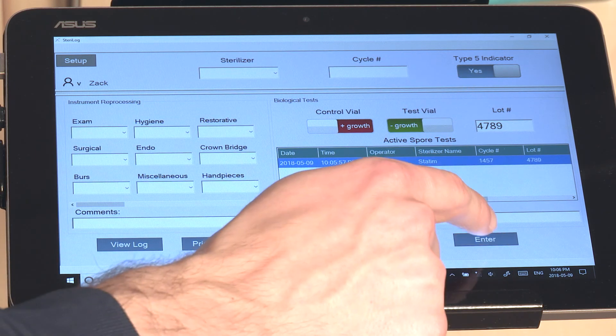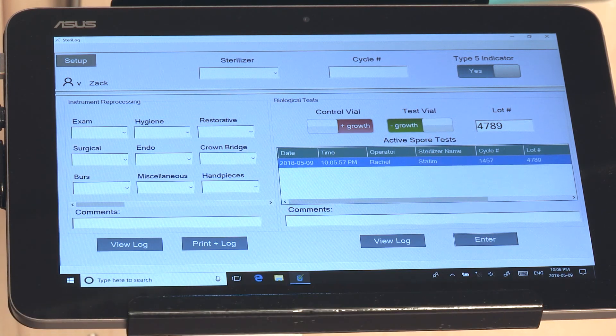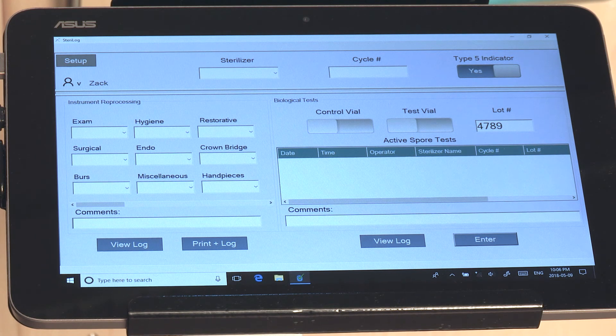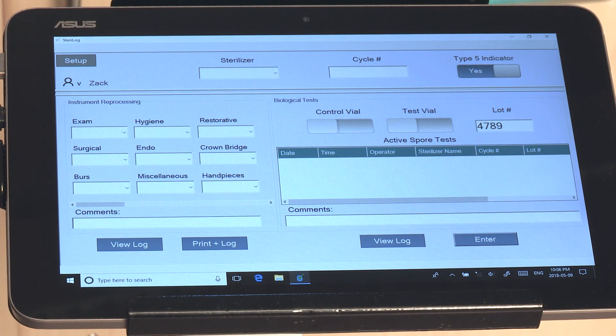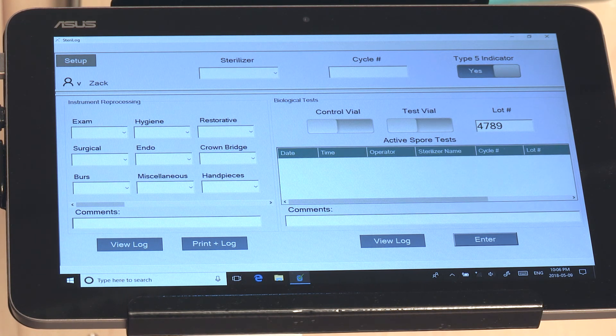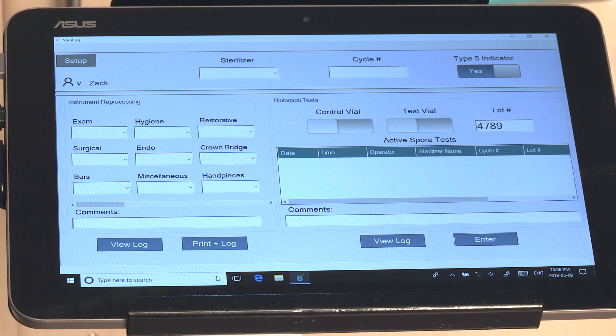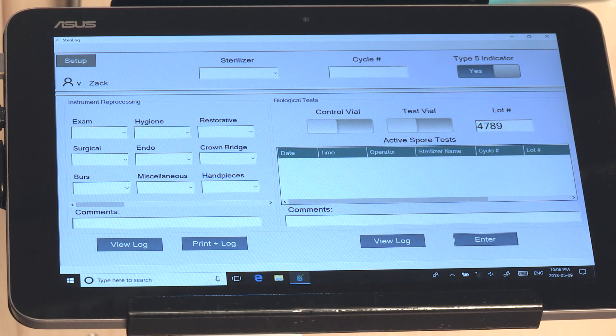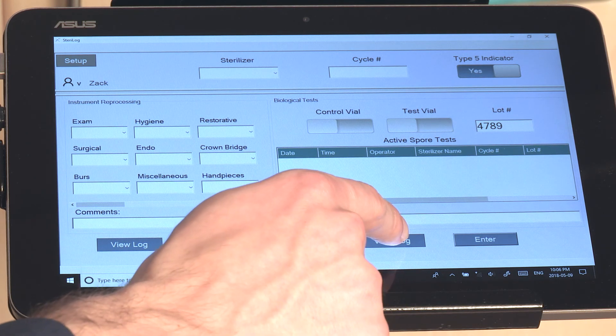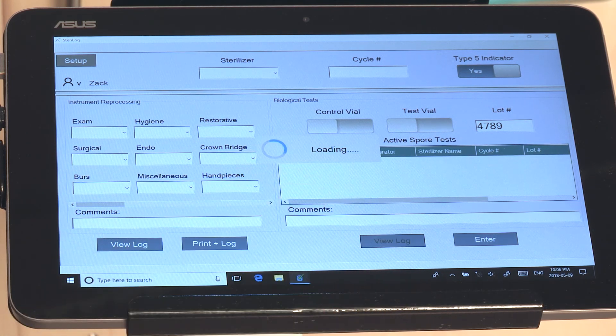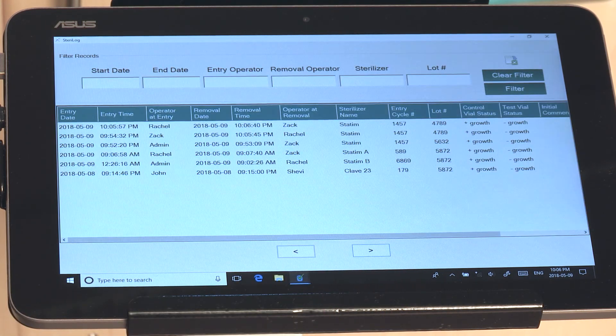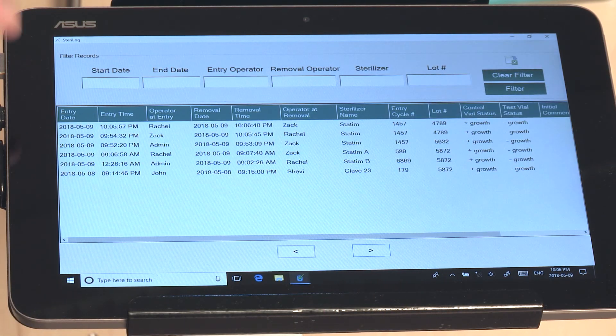You would then hit Enter to remove the spore test from its active state and pass it to the historical log. To view it in the log you would hit View Log over here and you can see the results.